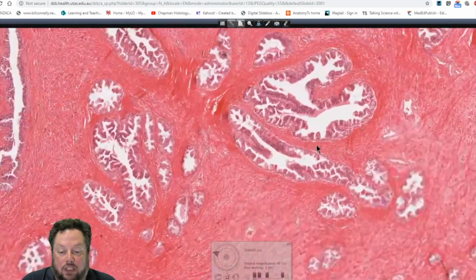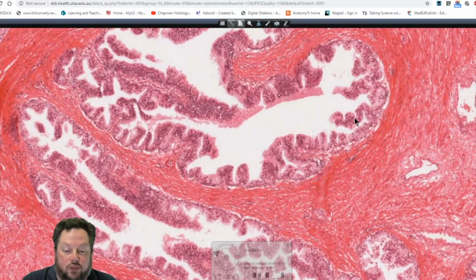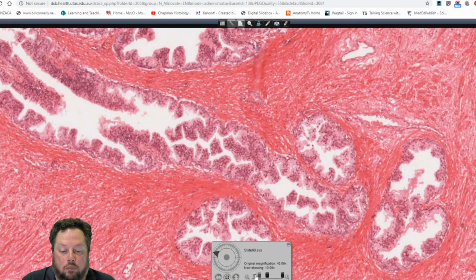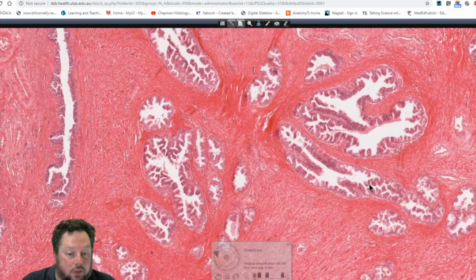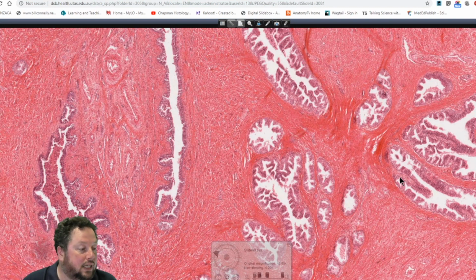So you can see the gland structure here. Again, I would not ask my students to actually histologically identify the epithelial type here, but be aware of its nature and its contribution to semen. Somewhere around 10 to 20% of the volume of semen comes from the prostate gland.